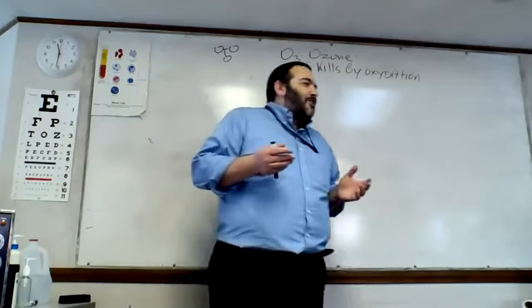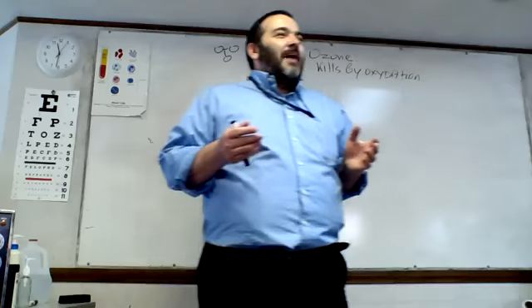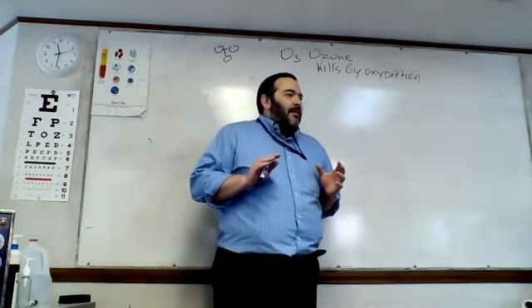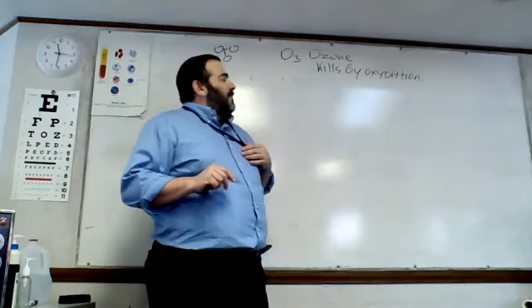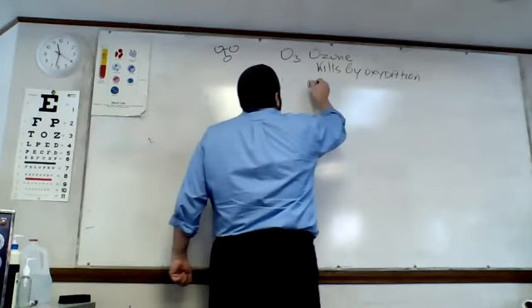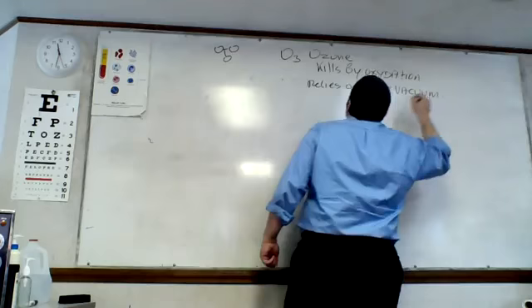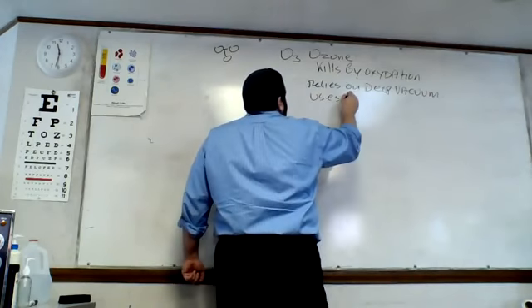It'll hang around together as an O3, but it really wants to degenerate back into O2 because O2 is really stable. But when it's O3, it will kill. Kill by oxidation. It also relies on a deep vacuum draw. It also uses Tyvek.